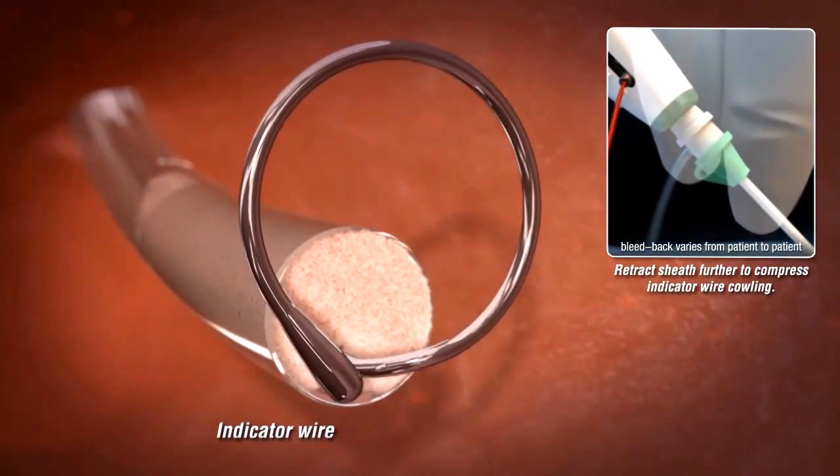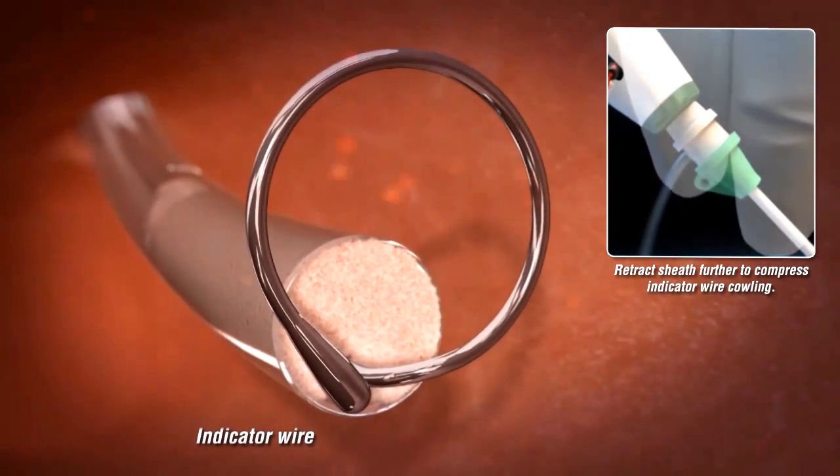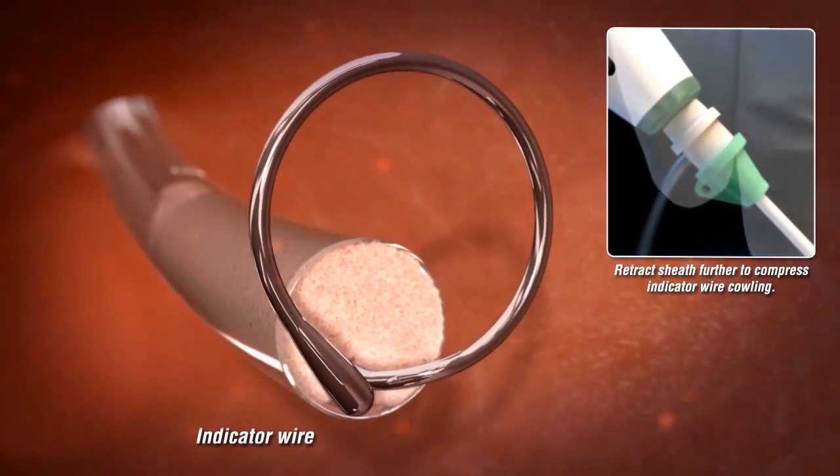The wire will automatically deploy, taking on its preformed hoop shape. When the wire cowling locks into position against the device handle, you will hear a click.